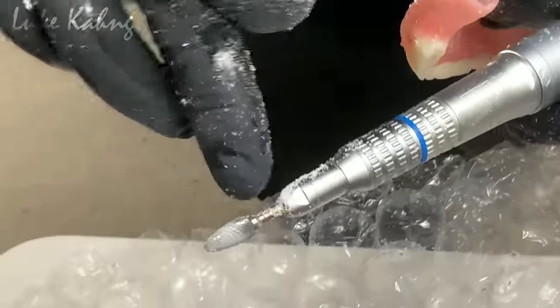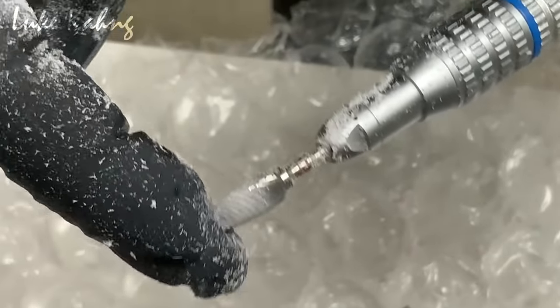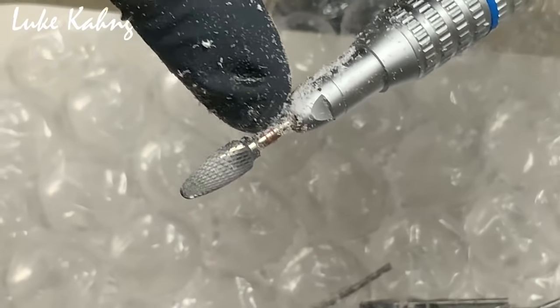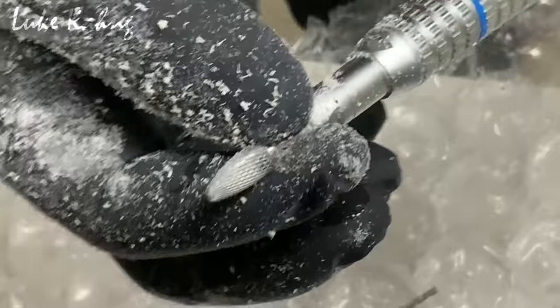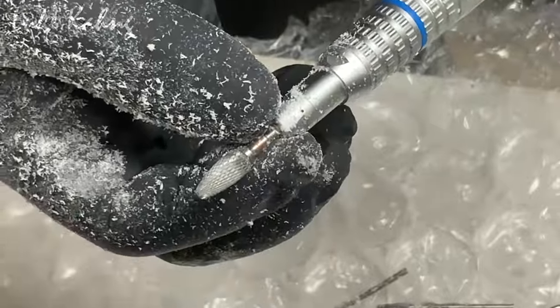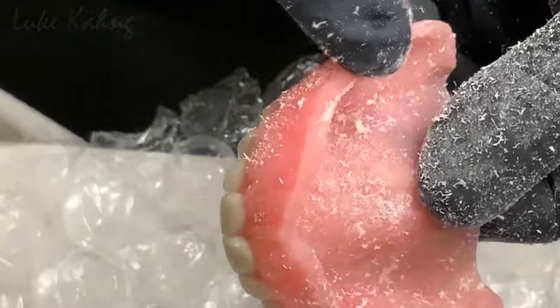And I make sure that I use a red fine carbide, this guy right here, the red one, okay? Always, I never use blue, green, any other color, anything that's not this, because this is going to trim it carefully, not trim too much off at the same time, and it almost leaves a nice polish at the end. It makes it much easier for you to polish.